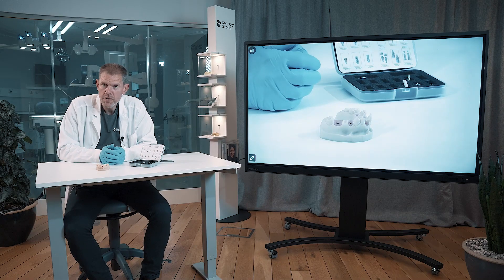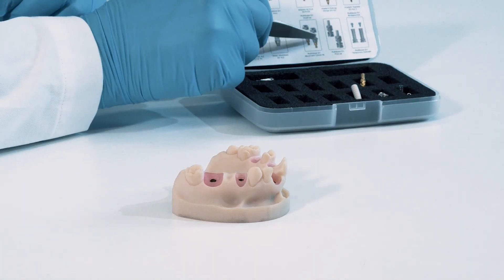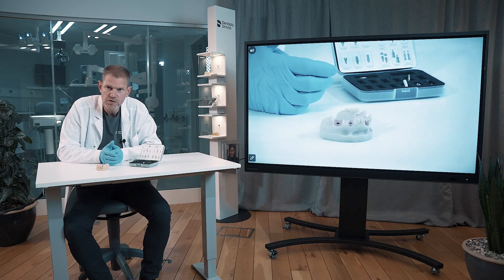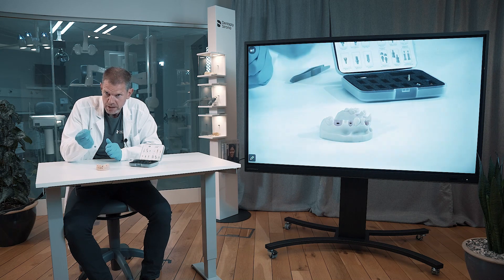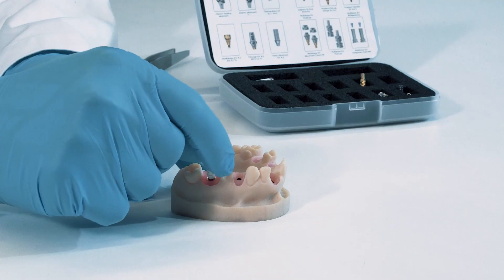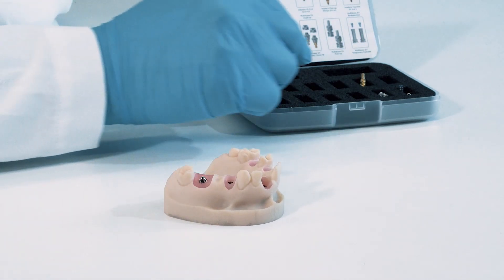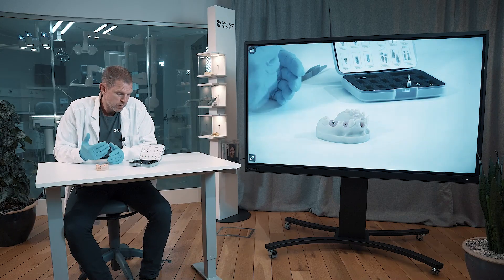In this box we also have the multi-base abutments — two of them to symbolize the bridge abutment you work with when doing a screw-retained bridge. In this compartment we have two abutments and two healing caps. I'll show you two different ways to install this abutment. They come delivered with a plastic holder that you can use when you install the first time — you just snap the plastic part like that. That's the most common way to do this.